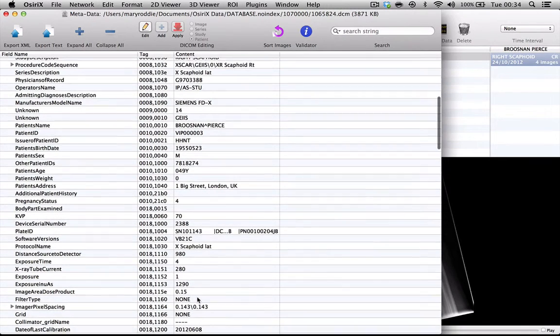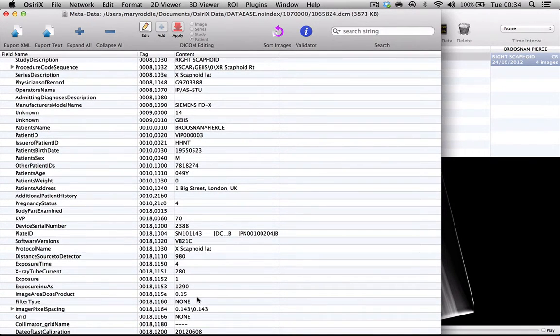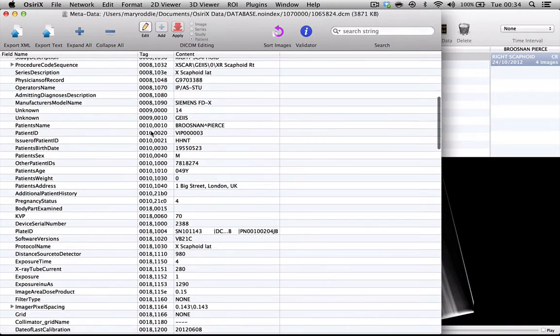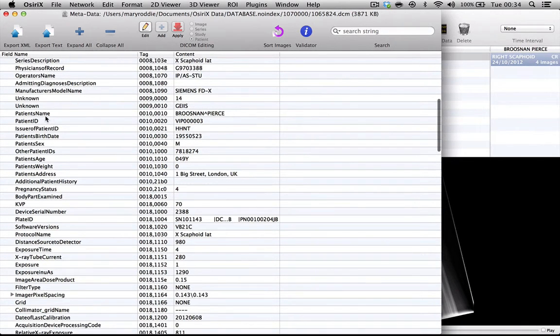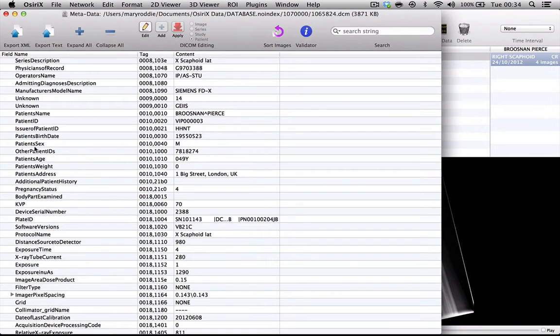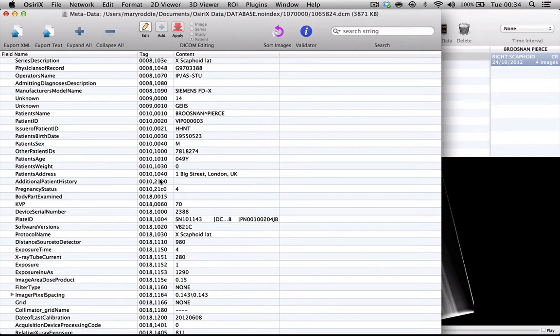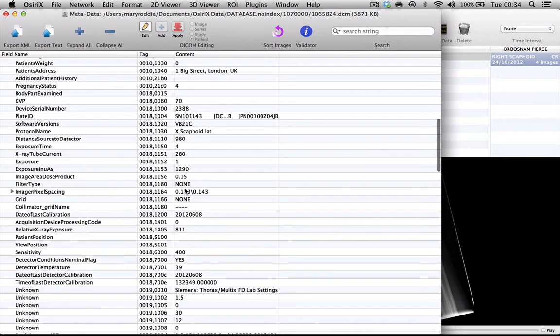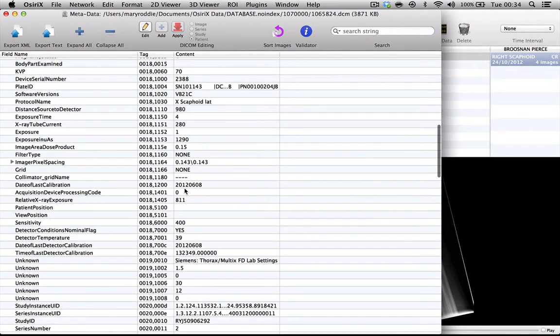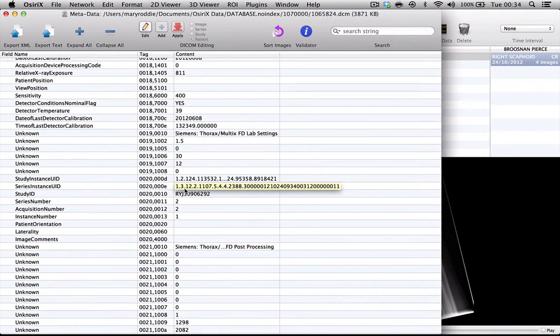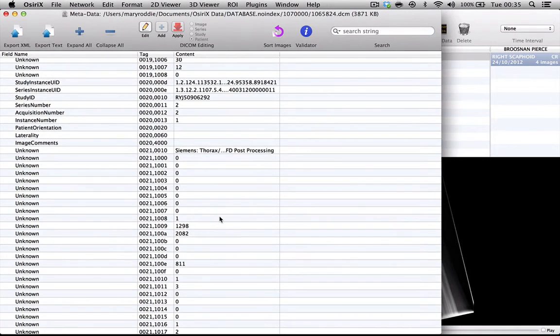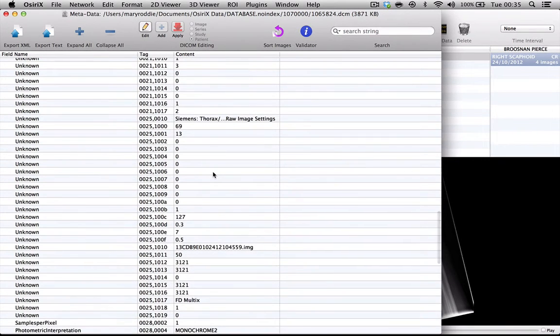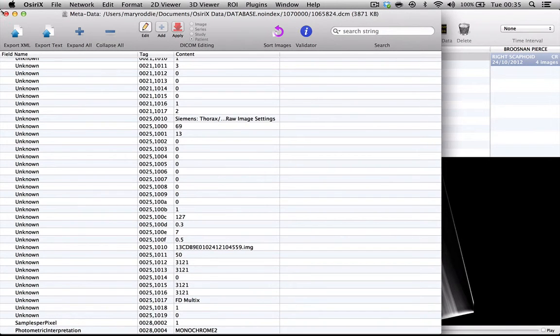The ones that we are most concerned with in anonymization are the numbers beginning with 0010 because these generally relate directly to the patient and include the patient's name, the hospital number, the date of birth, the weight, the address and the telephone number. This is the area that we need to get rid of information in, but it's important for you to realize that occasionally a hospital or department will put a value that can identify the patient in one of the other headers. So it's very important to check all these headers when you have finished your anonymization process.